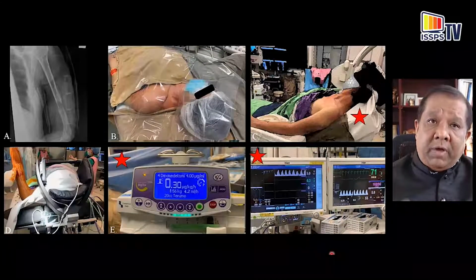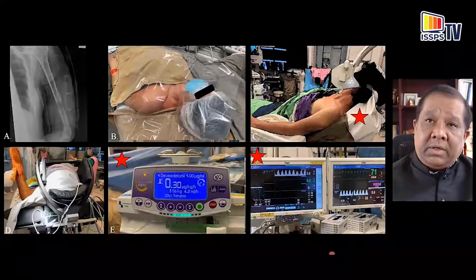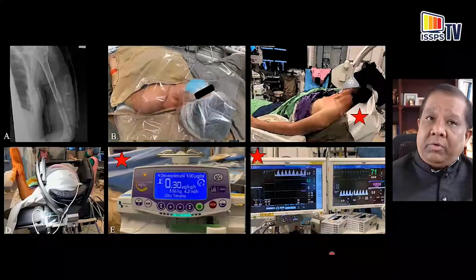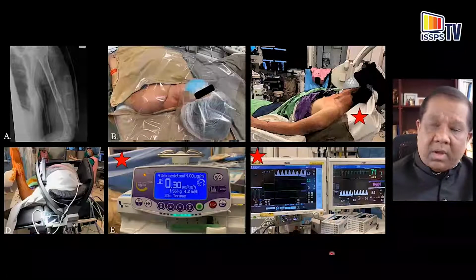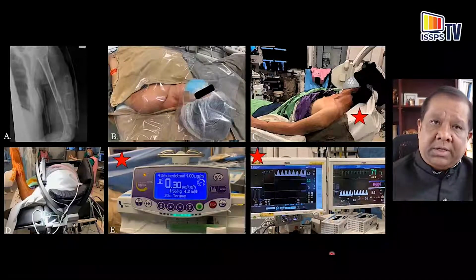So it can also be advantageous because of the detrimental effects of general anesthesia on cerebral perfusion and reports of cerebral vascular accidents following surgery in some of these unfortunate patients. So if you can avoid it in this beach chair position by giving regional anesthesia with more stable hemodynamics, it is desirable. You can see here patient is now listening to music through a headphone.